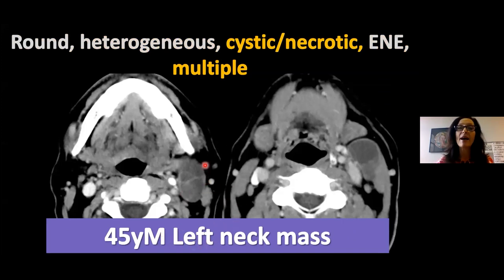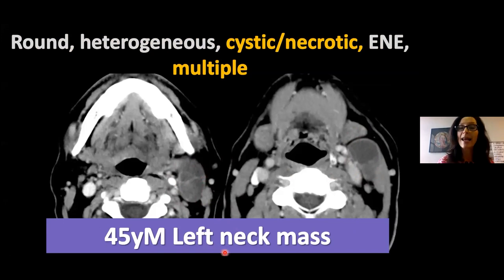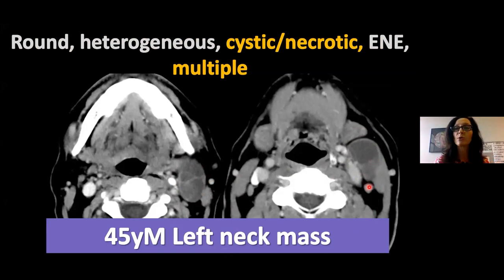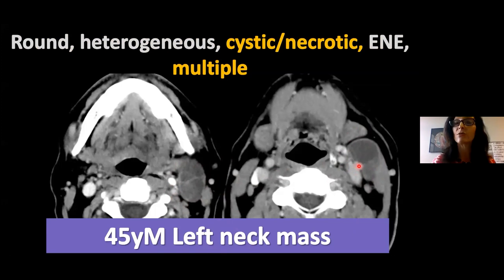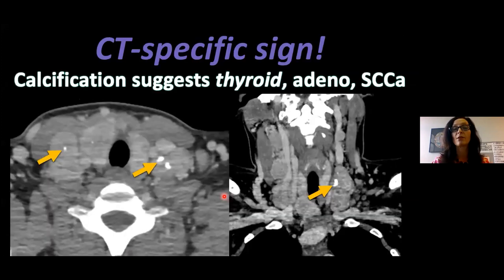Another case: a man presenting with a left neck mass. In the lateral neck, behind the submandibular gland, there is a cystic mass with a septation. This is not a branchial cleft cyst — a new neck mass in an adult is carcinoma until proven otherwise. This is cystic/necrotic, multiple lesions smashed together, with fairly sharp margins and no obvious extranodal extension — but it needs FNA. It turned out to be squamous cell carcinoma from the oropharynx. The primary was in the palatine tonsil and could not even be seen on imaging — proven metastatic squamous cell carcinoma.